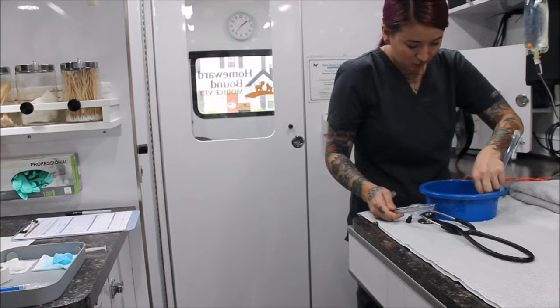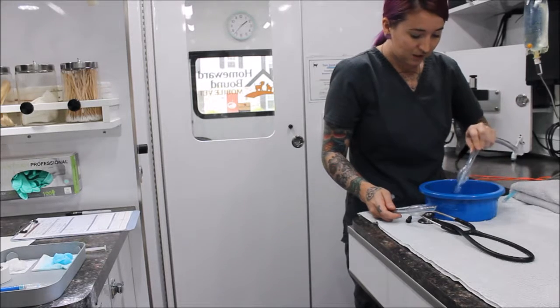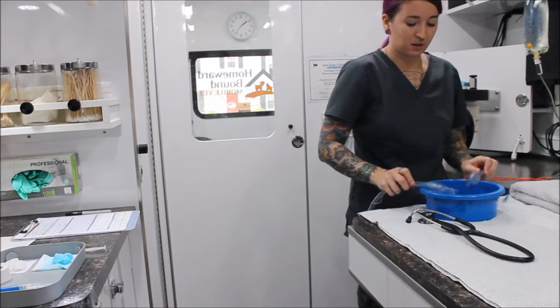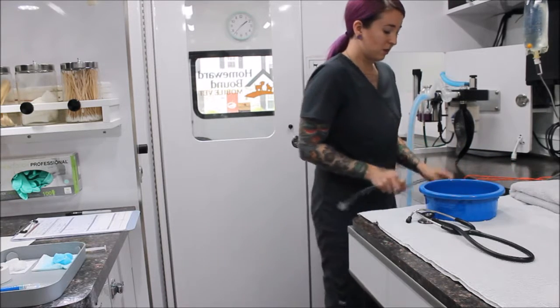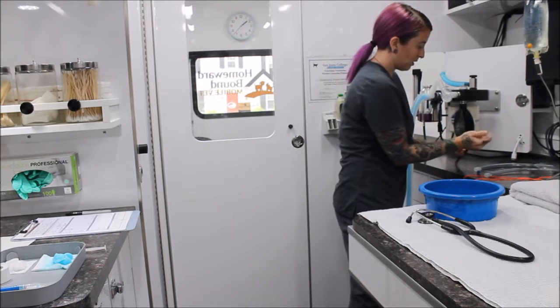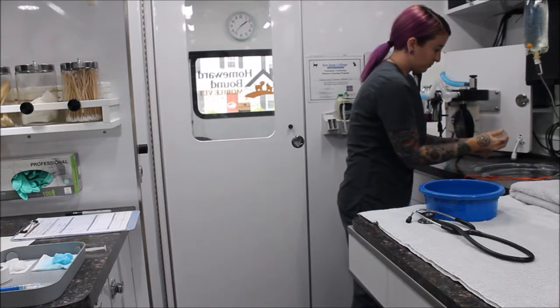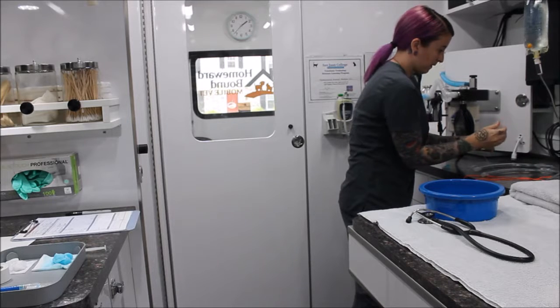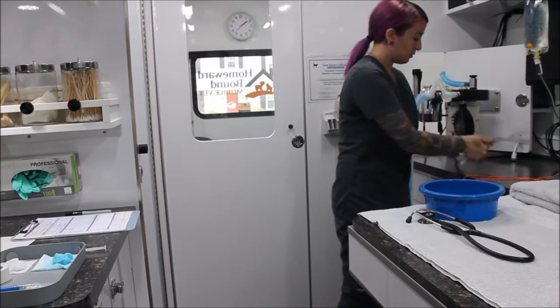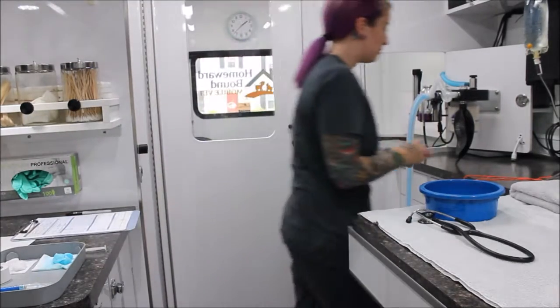I'm just going to submerge and check for any air bubbles, which would indicate that there would be a leak. This one is okay. And this one is okay. So I will dry those off before using them in our patient. And then I'm just going to go ahead and deflate my cuffs for my tubes all the way. Okay. So now I'm just going to set them over here. And that's where we'll be doing our induction.